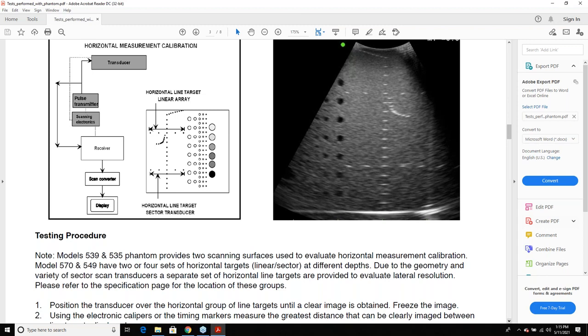Somebody didn't orient their probe correctly, because you have a marker. This is called the marker. It's not normally green. GE may have a GE up there, Philips may have a P up there, Acuson has a little A up there. So they do it differently, but it'll be on one side of the image or the other. And there's a marker on the probe scan head, and you have to make them look the same, or you'll get 180 degrees out.